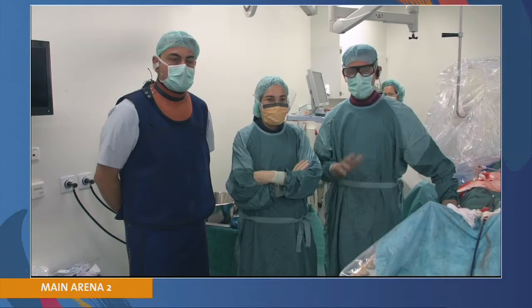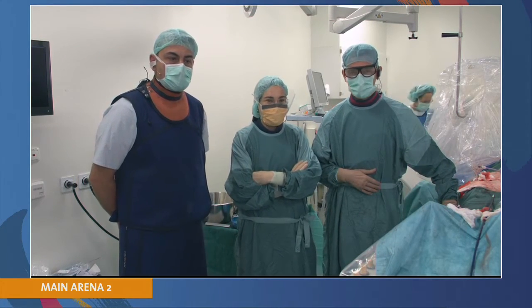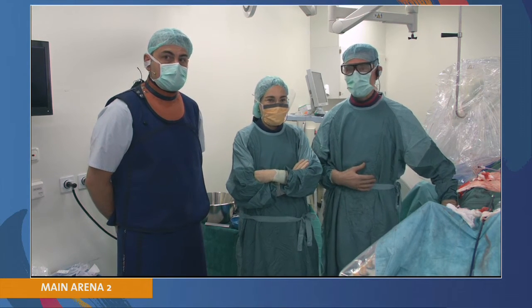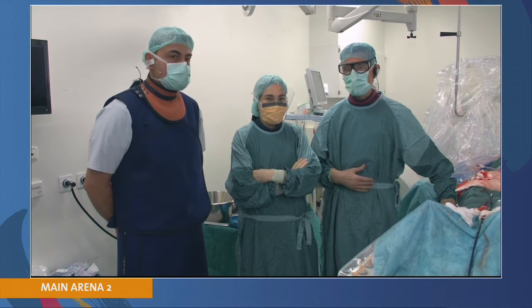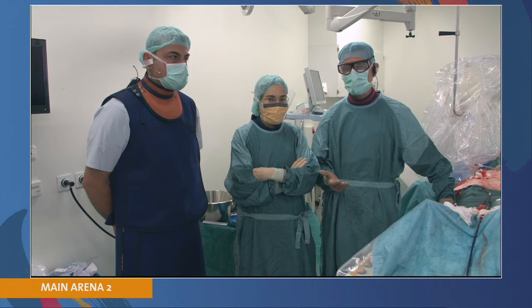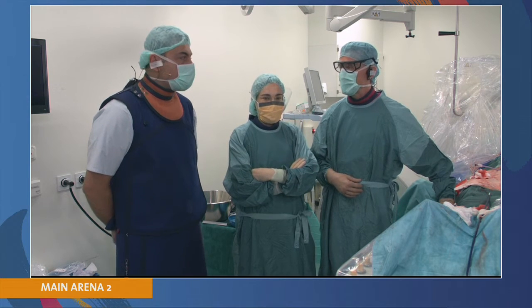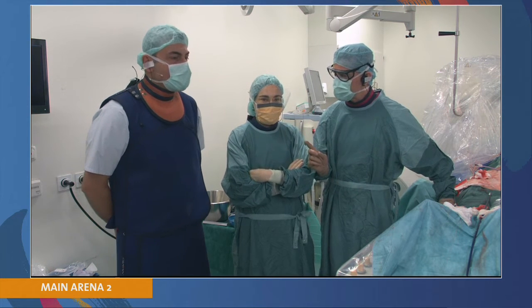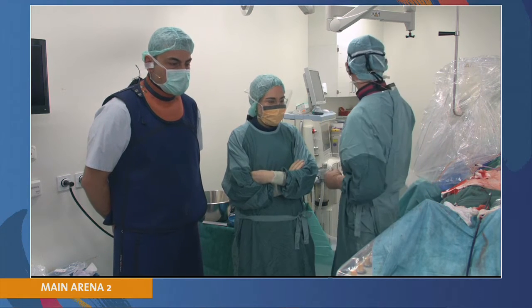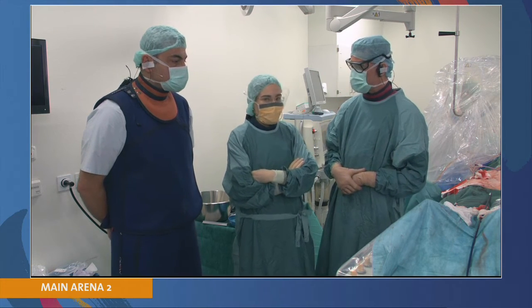Good morning. Can you hear us? We can hear you loud and clear. I'm here with Dr. Bransan, one of our vascular surgeons. We do all the stent grafts and aneurysmatic disease, thoracic disease together. We also have as a guest Dr. Kratimenos here from Athens, from the Evangelismos Hospital, also a vascular surgeon, and Dr. Otto from anesthesiology is helping us. Maybe Daniela, you can introduce the case.